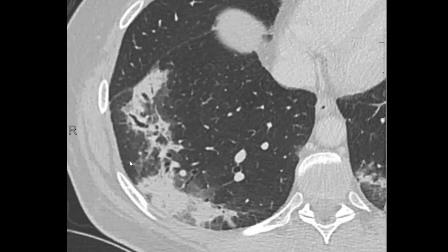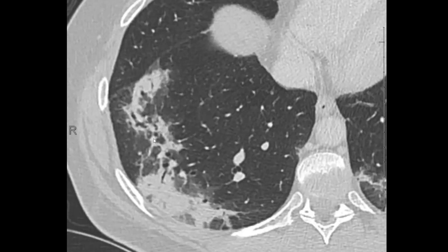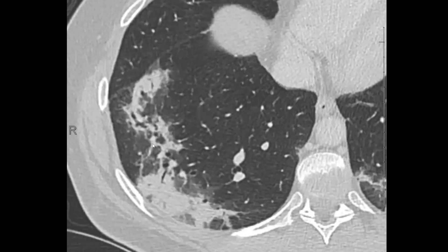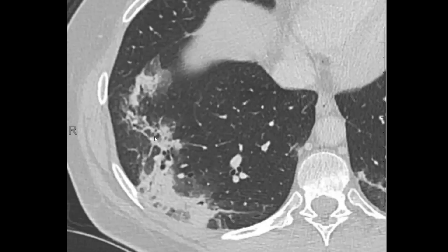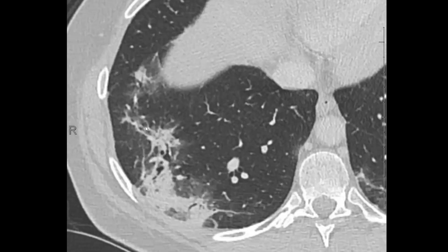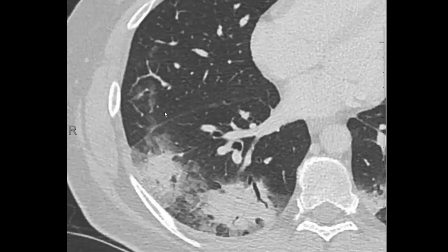Remember, when you say traction bronchiectasis, you are saying that this is irreversible bronchiectasis — irreversible airway dilation related to fibrosis. Most of these cases where you see these areas of bronchial dilation, they're transient. After the organized pneumonia heals or goes away, the airways very often return to normal or near normal. Even though it looks like there's some architectural distortion and bronchiectasis here, it's not really bronchiectasis — it's really transient bronchial dilation.